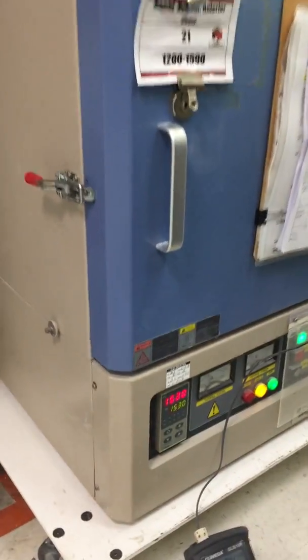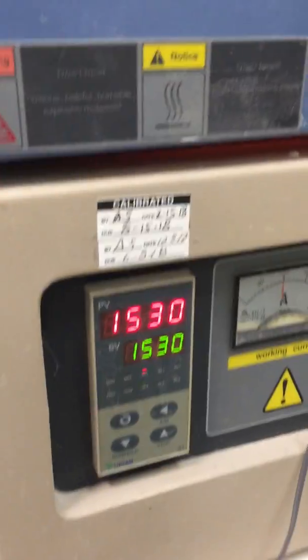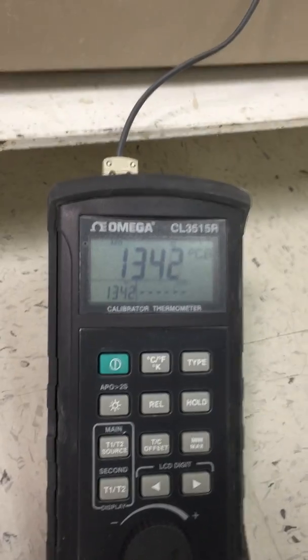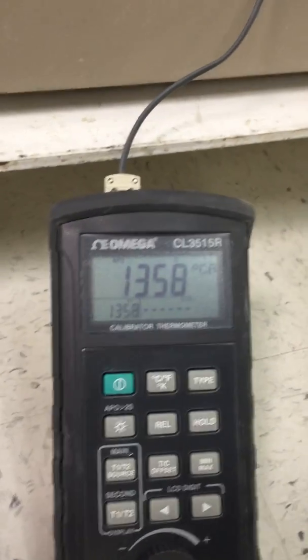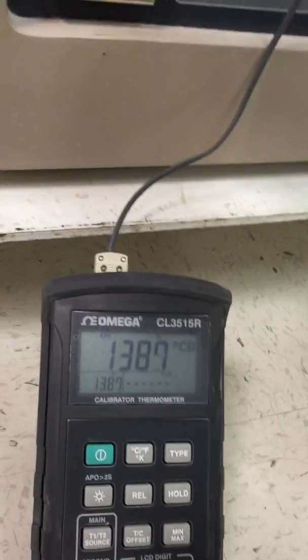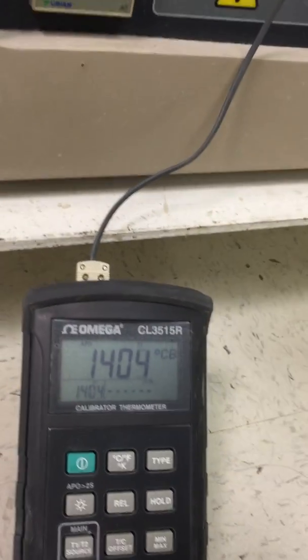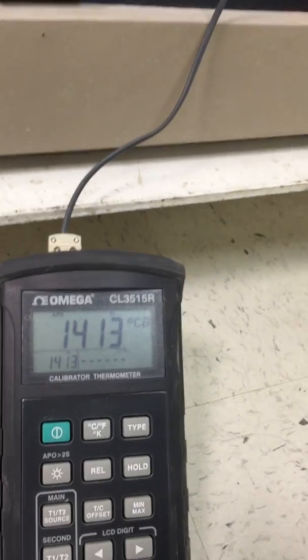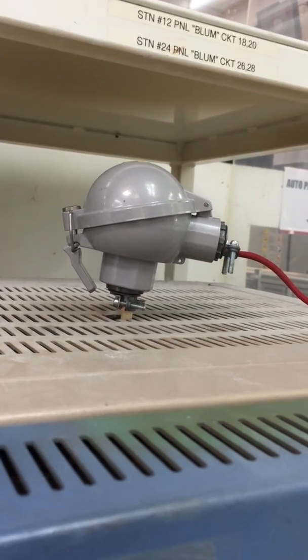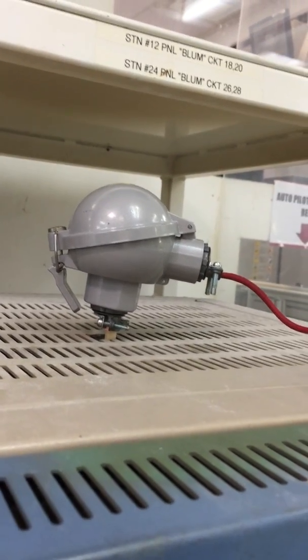Maybe another two minutes or so. That's why it's better to put the probe in when you're about to calibrate if it's already at the final temperature. You have to let the probe sit in there for at least a good five to ten minutes after it reaches the target — make sure it's right on the dot.